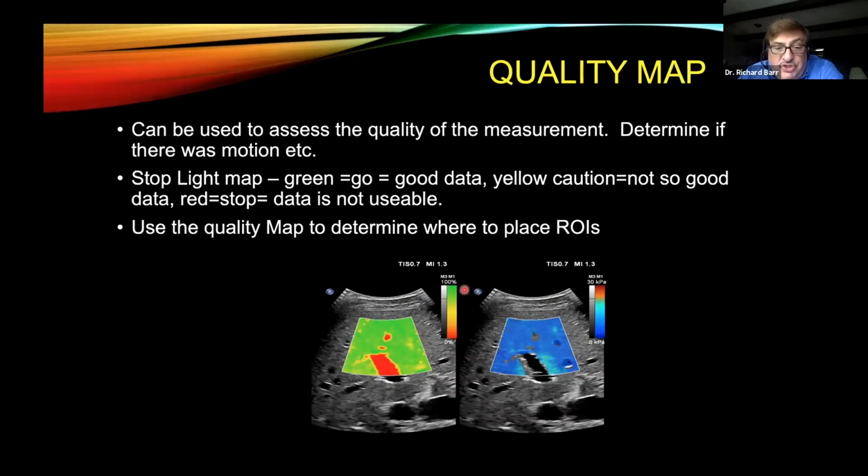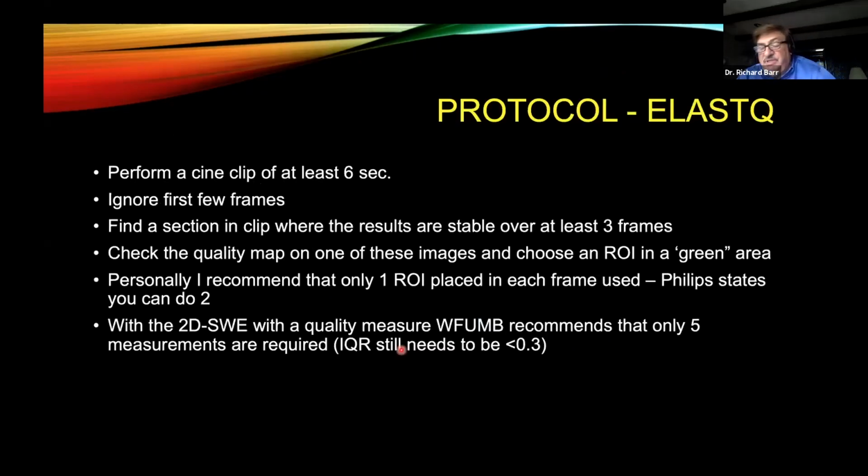And what we really want you to do is do measurements in these green areas. So here you can see where the blood vessel is, and it's much wider that it's red because we've got artifacts surrounding the vessel. These other little areas of low confidence are probably vessels here and here, but there may be vessels just in front of or in back of that are causing artifacts. So this will allow you to find that area that's green. So maybe in here or in here, we've got the best area to do our measurements, and that will really improve the quality of our measurements.